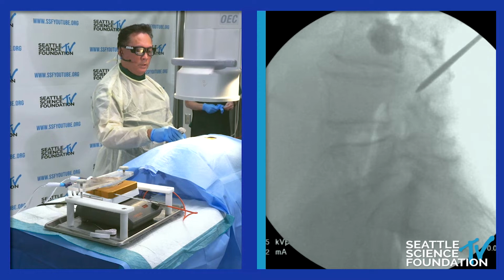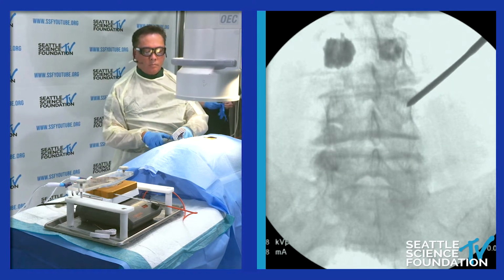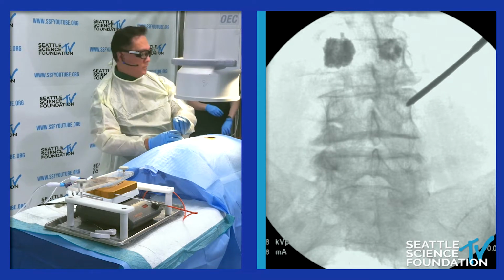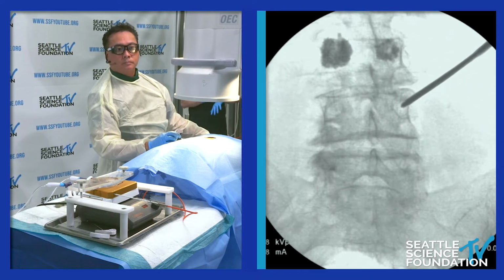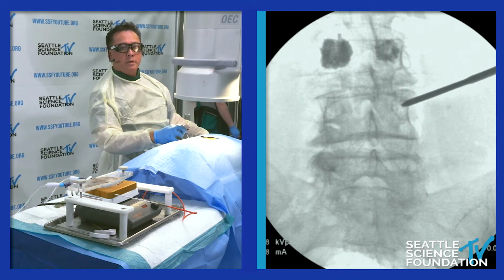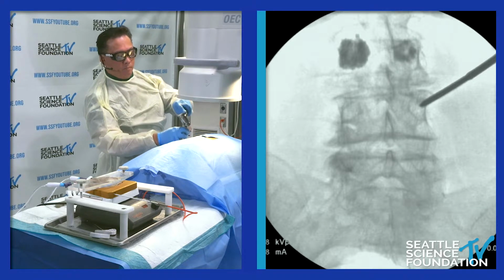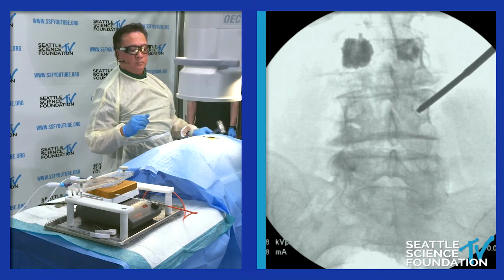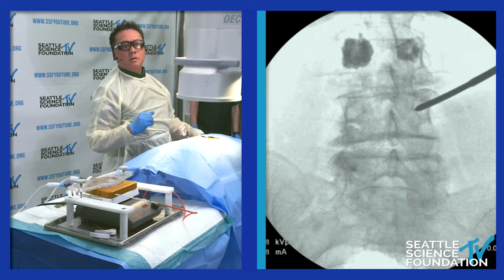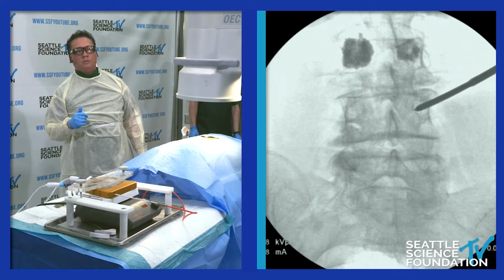I think it's very important that when you put the needle on the AP, what you can get into the... Can you hear me? Okay. I'm just going a little too medial. I mean, what I try to do, Udi, that's a great point, is I try to square up the end plate that you're working at, and then put the cannula so it's parallel to the end plate.